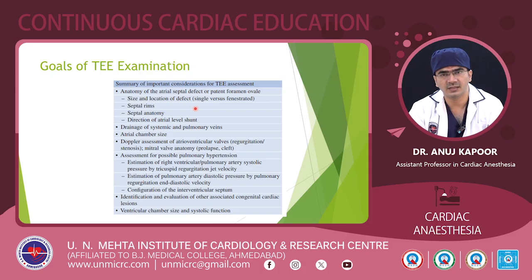As we will discuss in the further lectures on ASD, there are various types of ASDs: ostium secundum, ostium primum, coronary sinus type, and sinus venosus types of ASD. So we will have to confirm which type of defect it is, and also confirm whether any other defect is present or not. Septal rims, as we have discussed, the septal rims and their length, the septal anatomy, and the direction of the atrial level shunt.